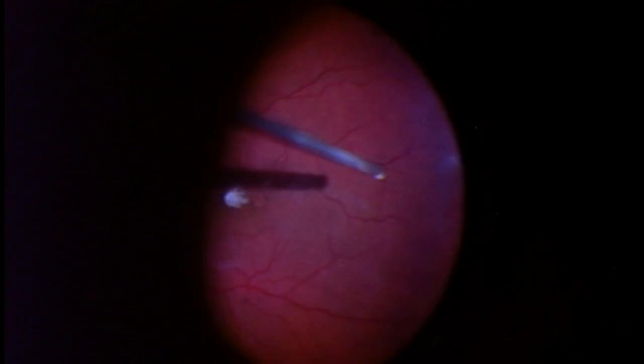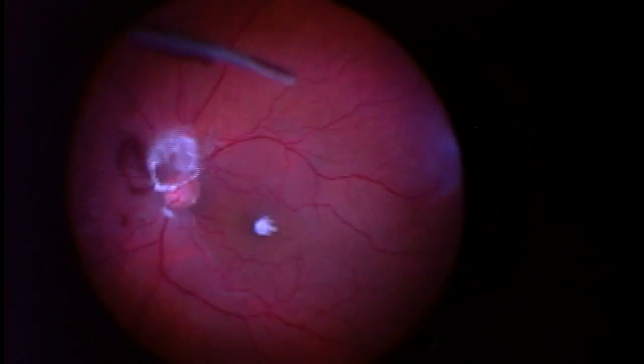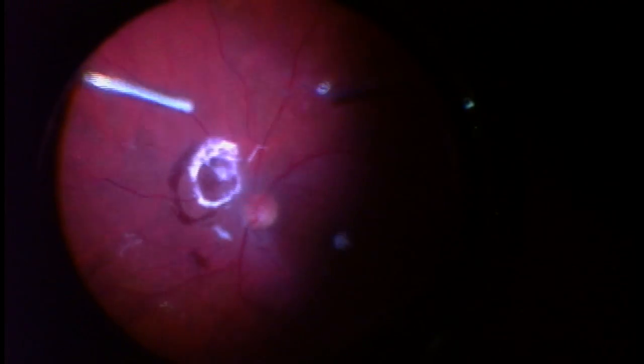For the rest of the video, what I'm going to show is that I'm going to go around the eye, around the sides, removing as much vitreous as I can. This has become quite safe. It allows me to efficiently remove as much vitreous as possible during an operation for whatever cause — but in this case, it's for removal of floaters, or FOV.